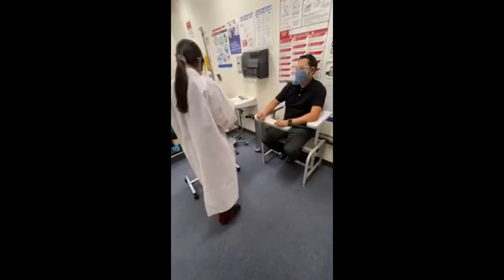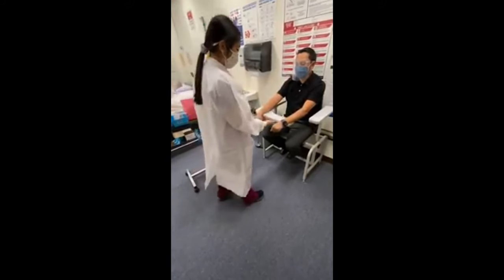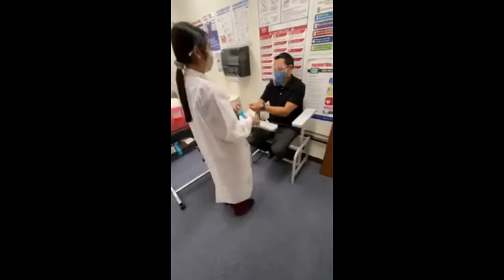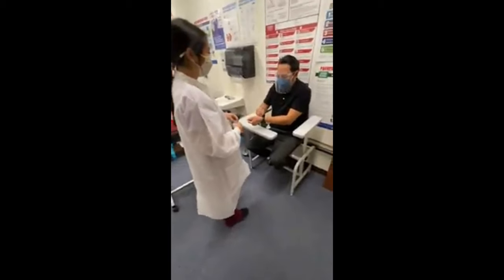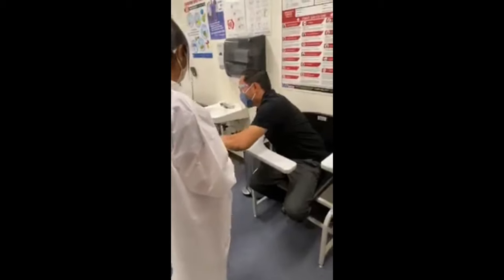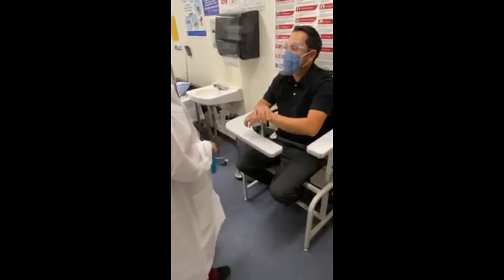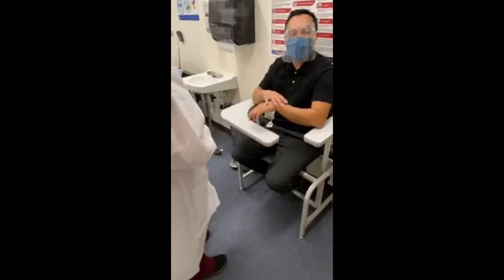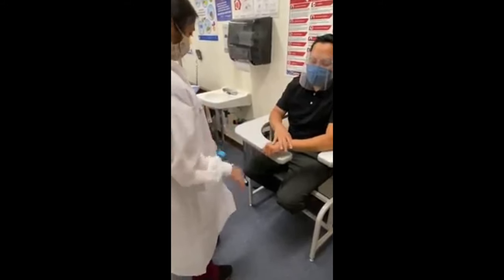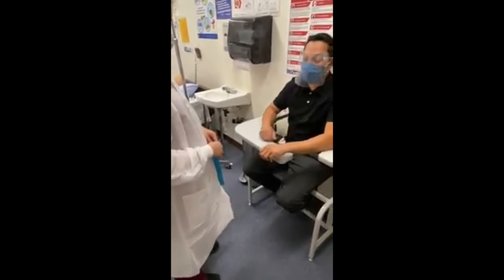Okay, I'm gonna check the vein. Okay, so you can use whatever arm you want, so it's not limited to this. Let's just use this. Can you please take off your watch and your ring and your t-shirt? But yeah, you can actually tell the patient, like, if it works for you, a watch especially, or anything that will obstruct, you can have them remove it. Because if you're sticking and the watch is in the way, or you can't put on a tourniquet, then it will affect you. So you can give instruction to the patient.